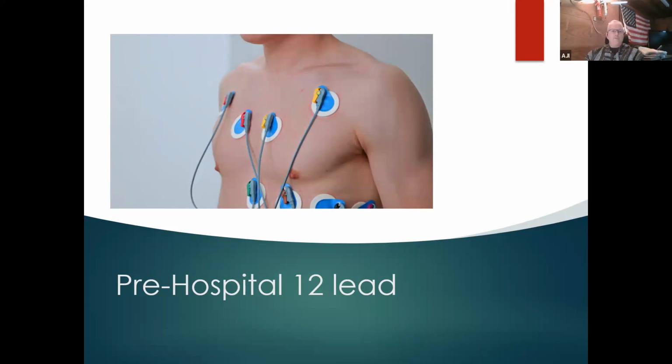the time from our assessment to the time they get to the cath lab where they need this life-saving treatment for catheterization can be shortened dramatically by doing this. So real quick, we're going to go over to the 12 lead and move forward with that.